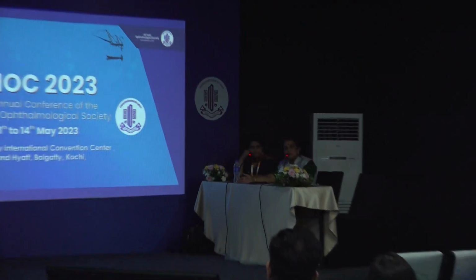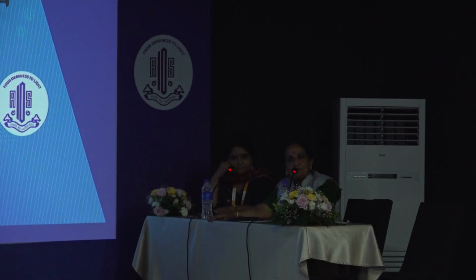Yeah. I had a less than 3-month-old baby, and the eye was a little small, with a corneal diameter of 10.5 and axial length of 17.5. Considering the difficulties of contact lens wear and patching, I decided to implant an IOL. The power was 42, and I implanted 30 diopters. Immediately post-operatively the hypermetropia was 15. After 1 month, it was 6 diopters. That is the growth. The child grows so fast that you cannot predict how hypermetropia would reduce.